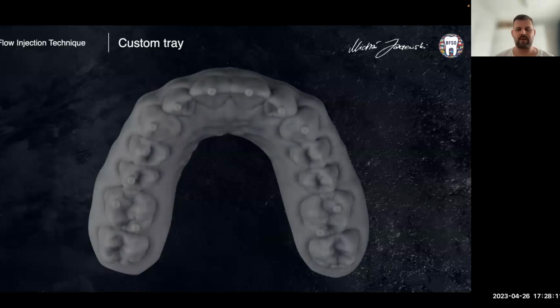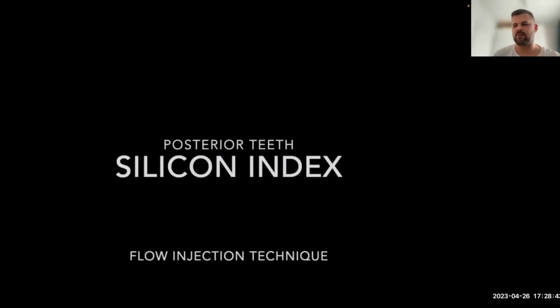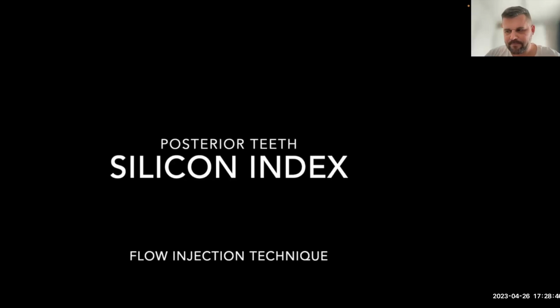Of course, you remember that in this digital era of dentistry, we can produce a digital wax up with these tubes, which will be a place for the hole. It will be easier to design this in the software. Just don't make this on your own when you have your silicone index and you need to prepare these holes and you are not sure what position you will get for the hole. So sometimes it will be helpful, and I make the silicone index right now like that.